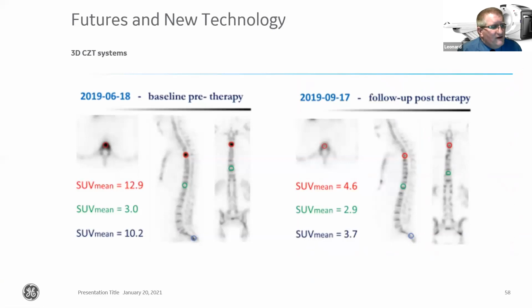But it does mean we're moving towards quantitative imaging. So we're trying to measure what the lesions are that we're detecting and change our management of these patients, ultimately to make sure that if we see a disease, we can characterize how active it is. And this is then specifically, in this case, for a metastatic lesion from a cancer, then we can treat that and see how it responds to what we're doing, whether that's chemotherapy, radiotherapy, or even, as we had before, the radionuclide therapy, where we had it with that prostatic patient specifically.